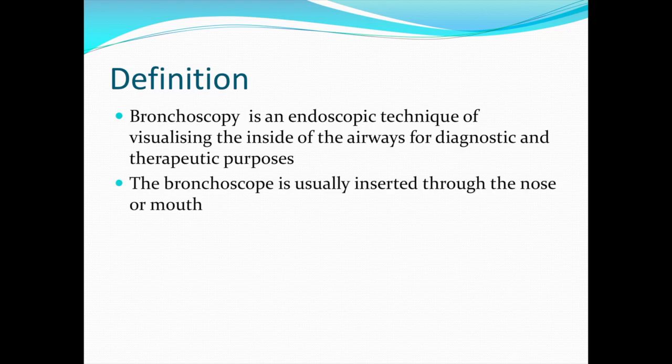It does have its advantages, however, in clinical situations such as massive hemoptysis, removal of a large foreign object, or stent procedures. Flexible bronchoscopy is the most common type of bronchoscopy in critical care. The flexible bronchoscope has a mechanism to flex or extend its distal end, which allows access to otherwise inaccessible areas. And there are some variants of this traditional flexible bronchoscopy, such as endobronchial ultrasound, shortened to EBUS, which is used to facilitate needle aspiration of enlarged lymph nodes.